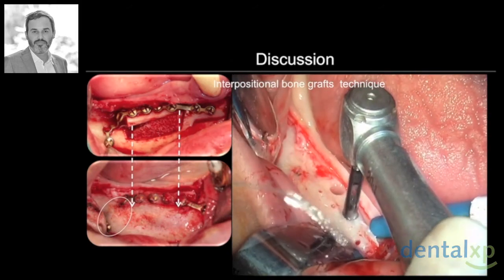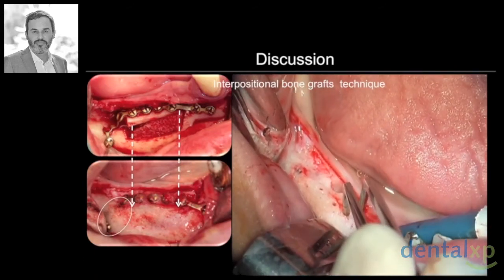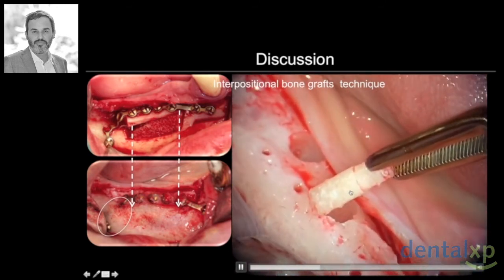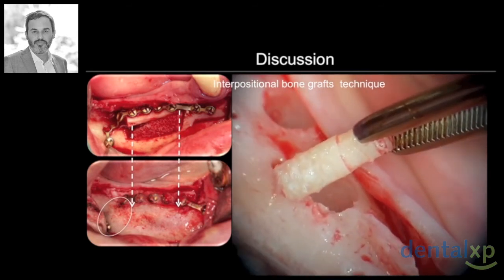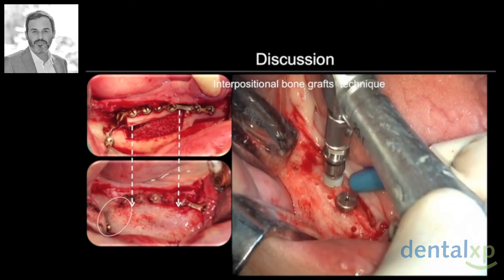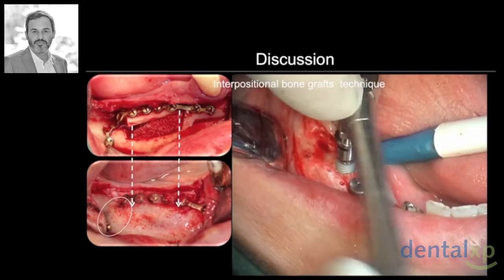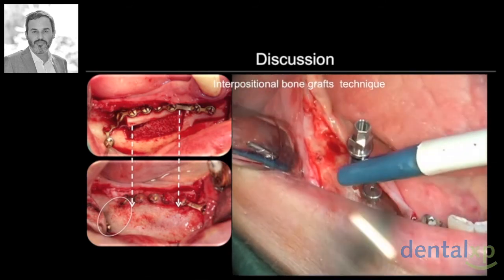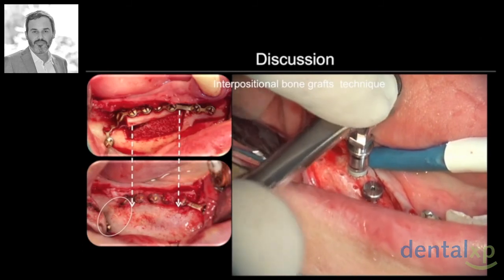We prepared the histology showing exactly the passage between the native bone and regenerated bone. And when we insert the implants and immediately reach high torque, we must unscrew and screw, and unscrew again the implant to avoid stressing the crestal bone, like in this video.